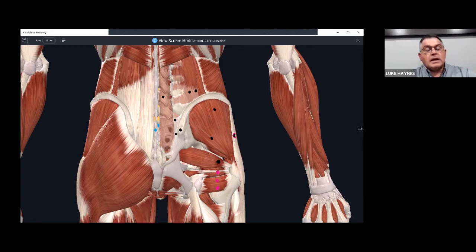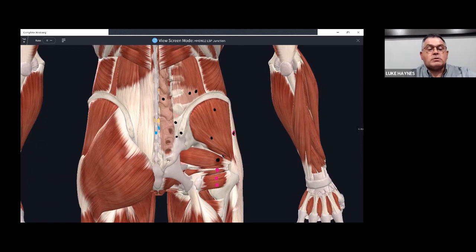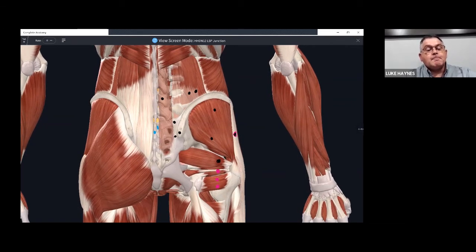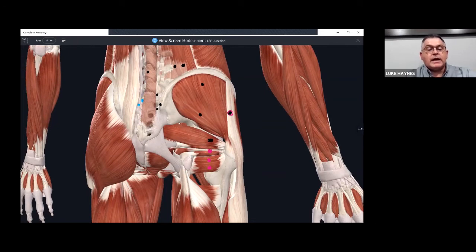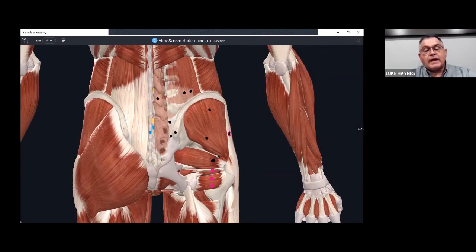Muscles here, again, multifidus, longissimus, iliocostalis. We'll get the iliolumbar ligament next when we go to our sacroiliac business, our ligaments that we set here. We'll go ahead and catch the interspinous, supraspinous ligament there. And then lastly, go ahead and hit the pelvic rotator cuff, piriformis, the IT band, and the deep rotators. This is kind of a shotgun approach, but these are a lot of the things that we may need to needle all at one time. If there are multiple comorbidities going on, just treat it as that lumbosacropelvic junction.